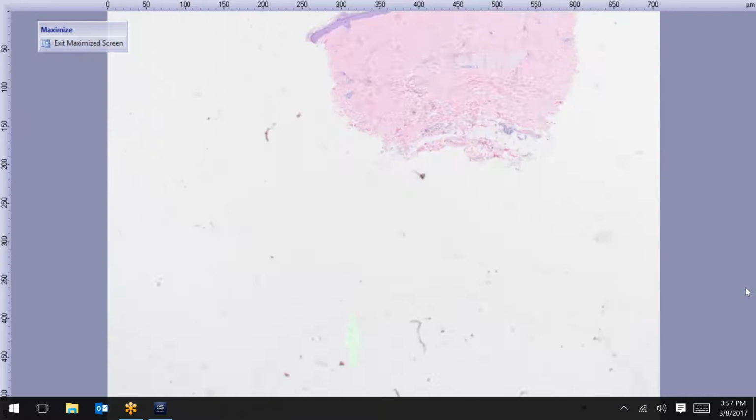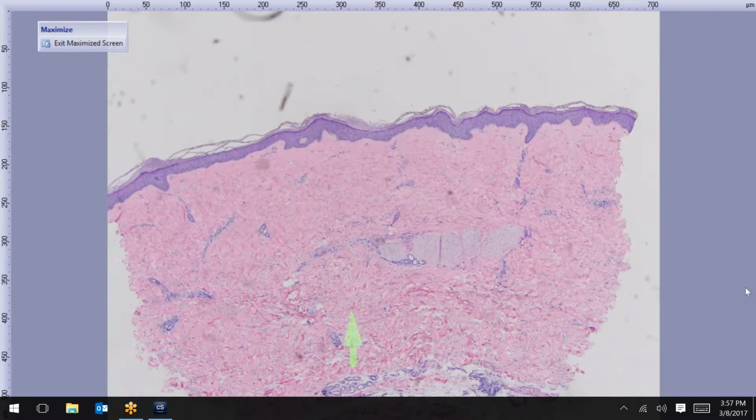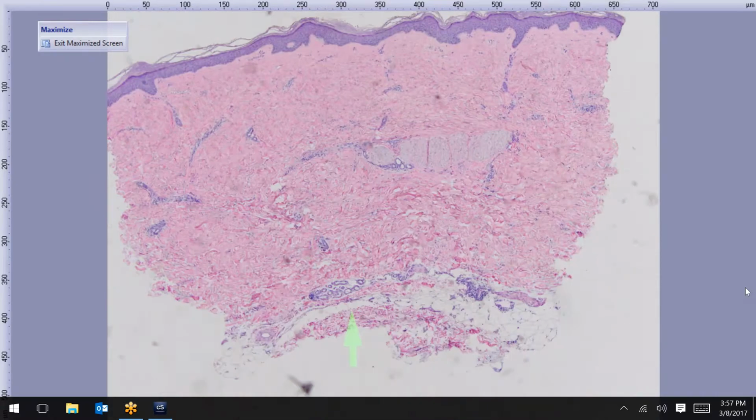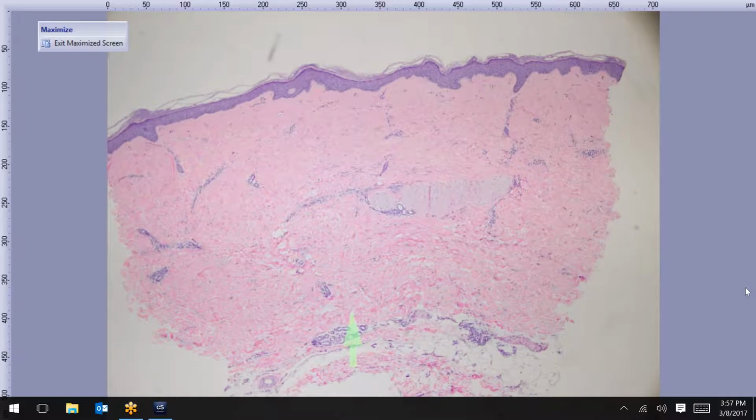Okay, another one. Anybody want to take a shot? Diagnosis?